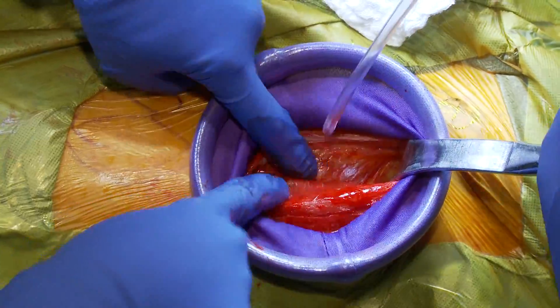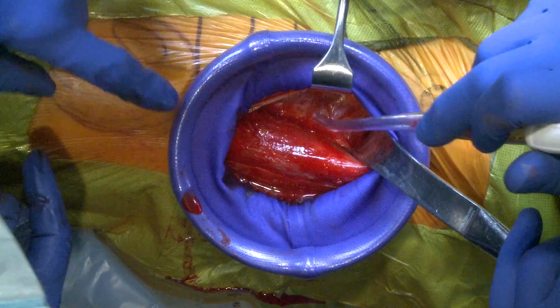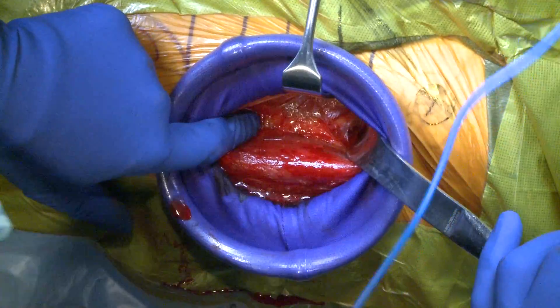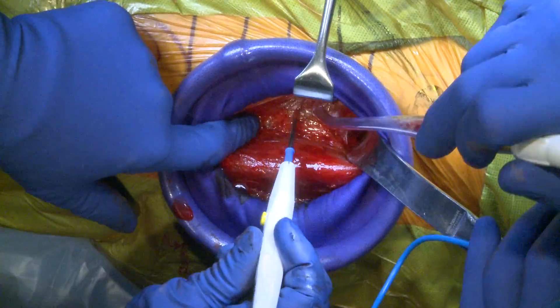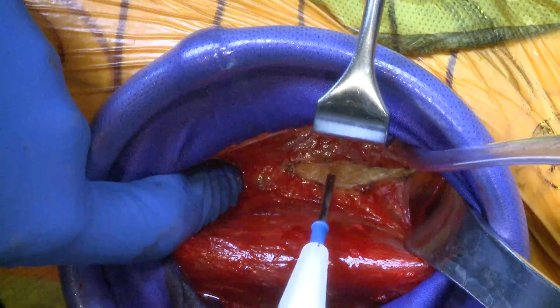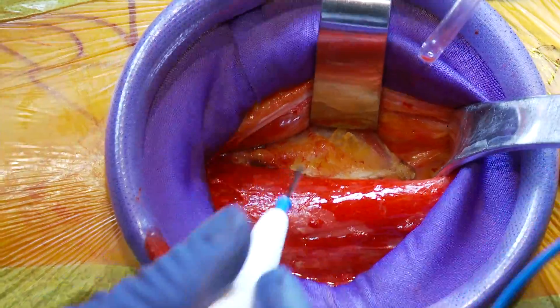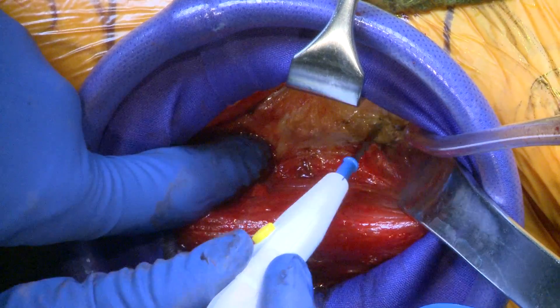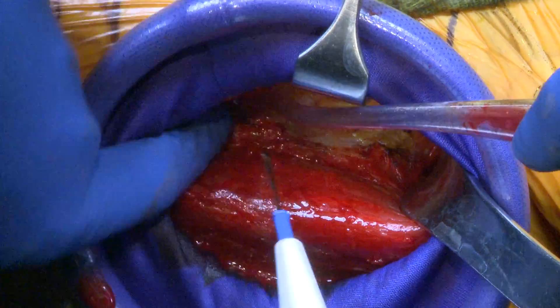Now getting into the deeper layers — I'll take a Langenbach. The assistant on the other side of the table is going to be retracting the rectus femoris. The deep interval is between the gluteus medius and the rectus femoris. You can see the gluteus medius right there. We're going to be mobilizing that muscle medially, and then we start to see fat. Another relevant anatomy in this area is the lateral femoral circumflex vessels.